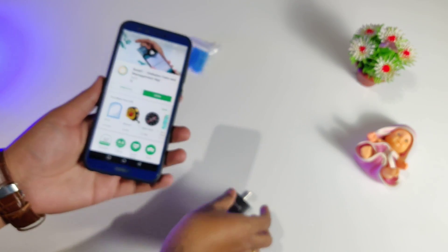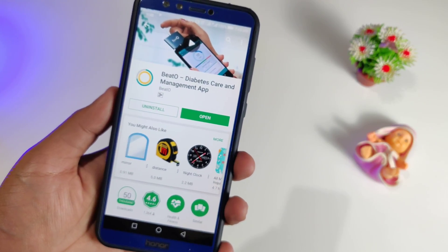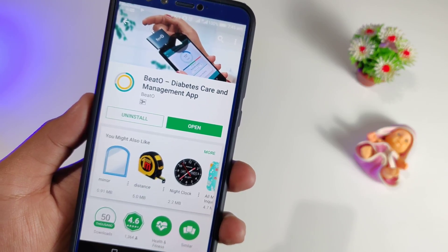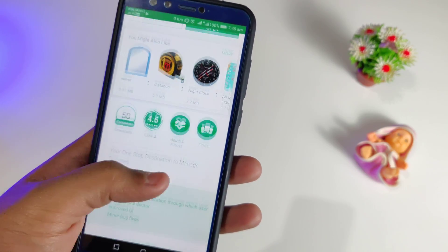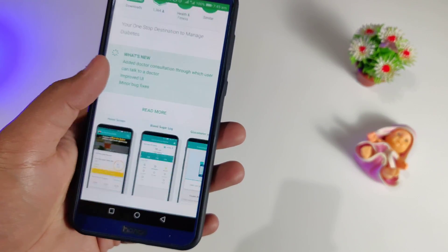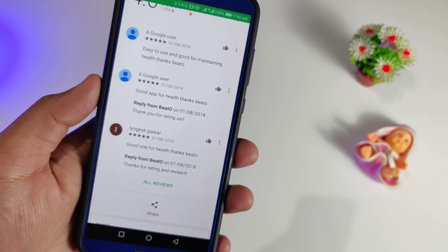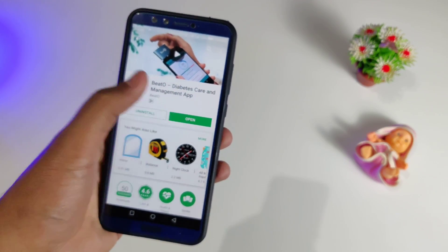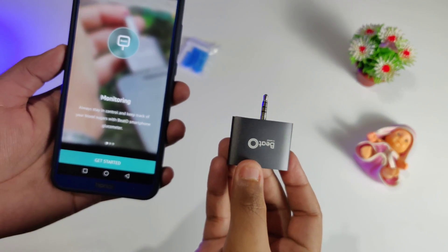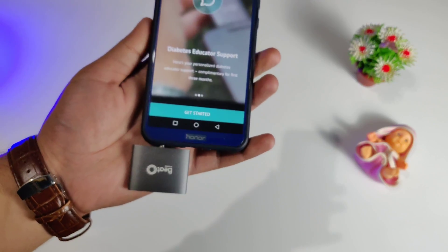The first thing you are going to do is install the application which is called the BeatO application. As you can see on the Play Store it has a rating of 4.6, and this one is an Indian brand so many of the people using it are from India. If you believe in the product then definitely check it out, and if you have faith in the company then go with them, because not many glucometers have that much rating and that much response from people.